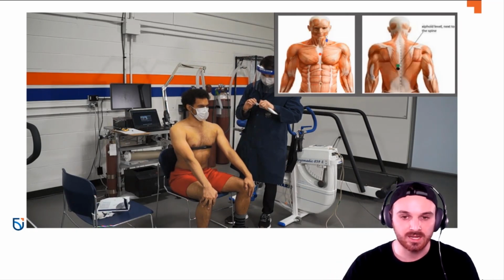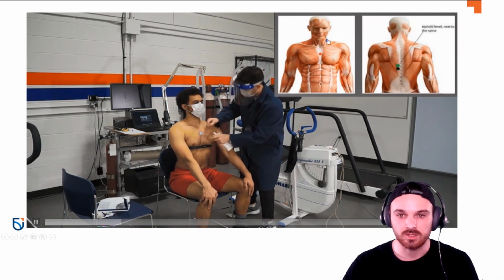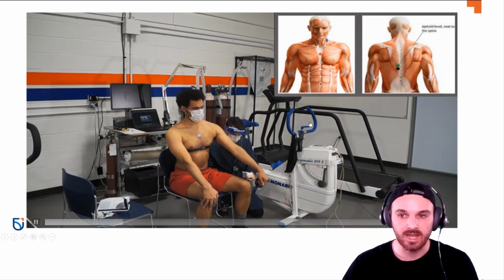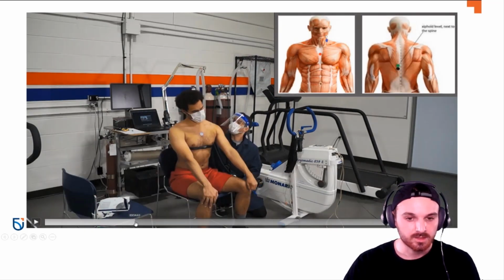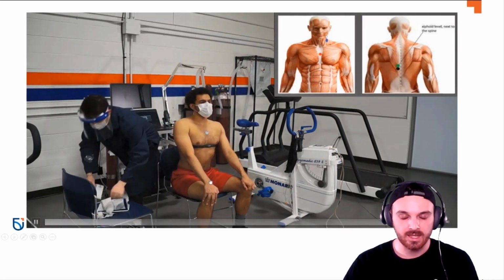So I'll skip ahead here, but essentially I'll do that red marker first. I'll do the white and blue on the neck, the orange under the arm, and then the black and green on his back. So there we go. Skipping ahead, those are done.